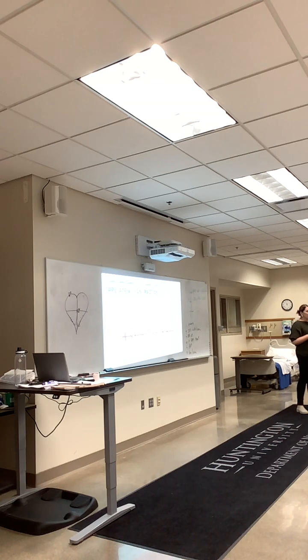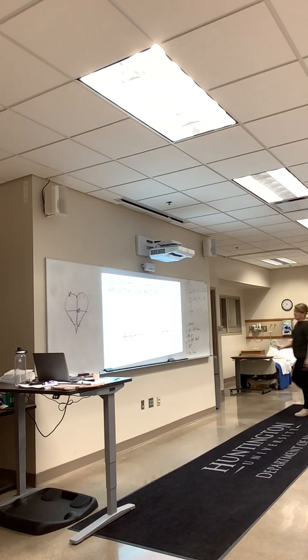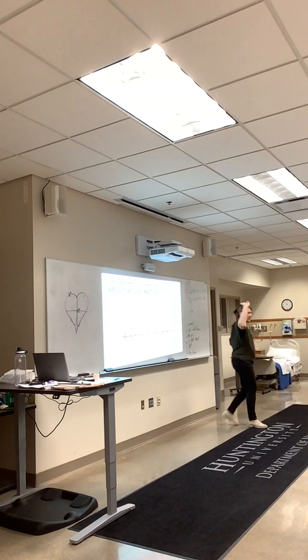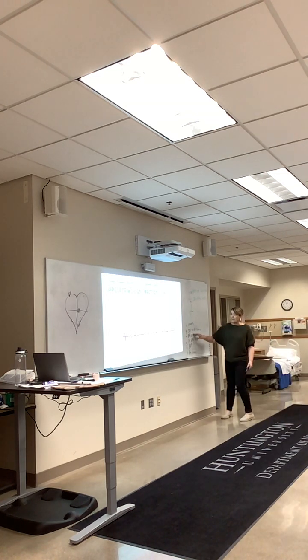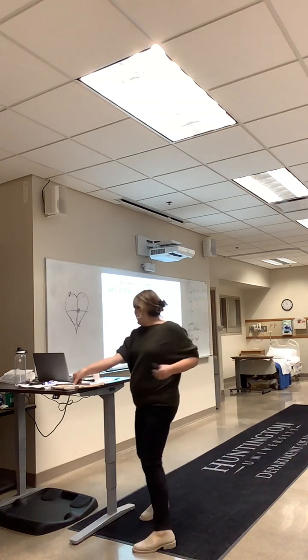If it comes from somewhere else in the atrium, I want to talk about a PAC. A PAC is an extra atrial beat, right? If I look at this, it's not regular. I want to see, do I have P waves? Yes, I see some P waves on there, right? Check that one off my list. Is my QRS wide or narrow? You all can tell that. My PR interval, let's look at that puppy. Does my PR interval look okay to you guys?